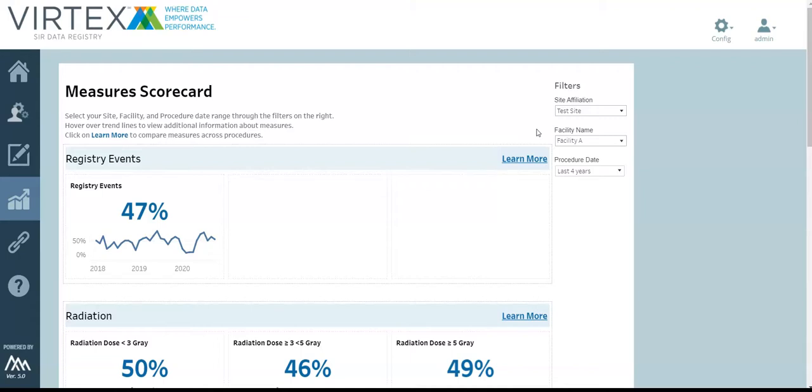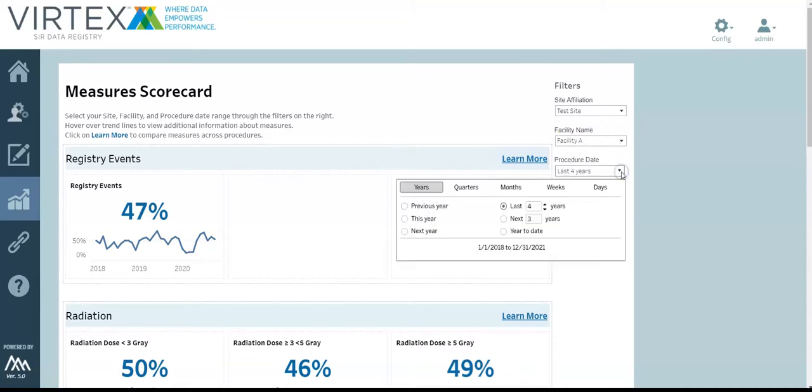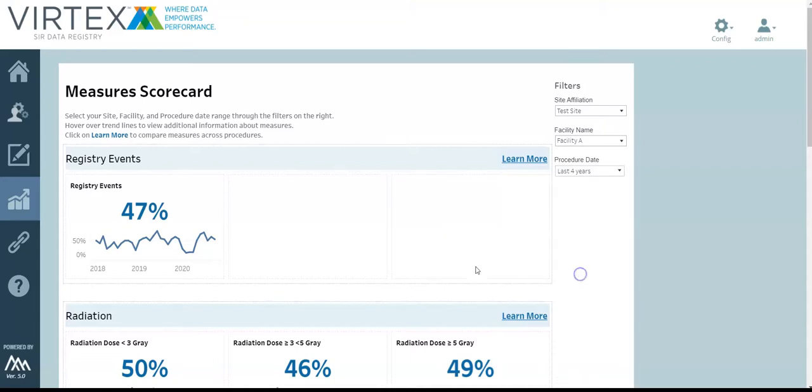Let's begin with the measure scorecard. Within the report, you can filter based on your site, facility, or procedure date. The measures are grouped by section, including registry events, radiation, contrast, anesthesia, and MIPS.